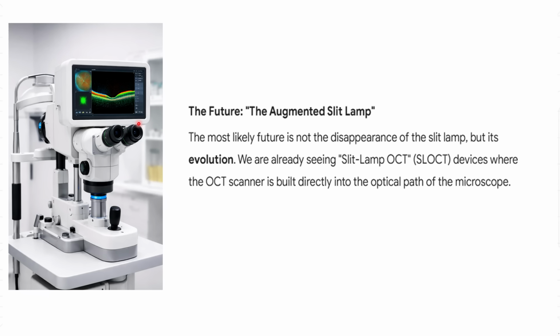When you need objective evaluation, you will use the OCT, but sometimes you need your integration and your subjective evaluation, so the role of the doctor will still be there. There will be no forgetting of the slit lamp. There will be augmentation of its role by the integration of the OCT and also the integration of AI, so the image will be integrated by AI as well.